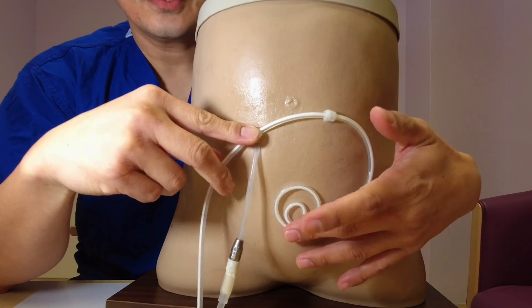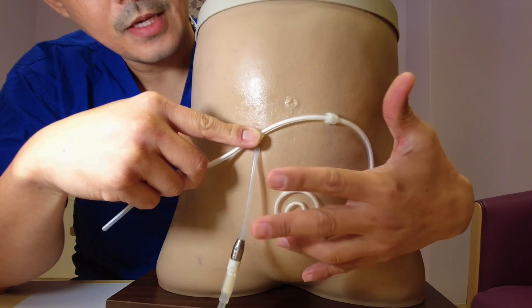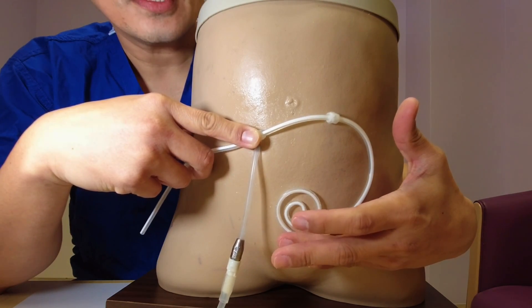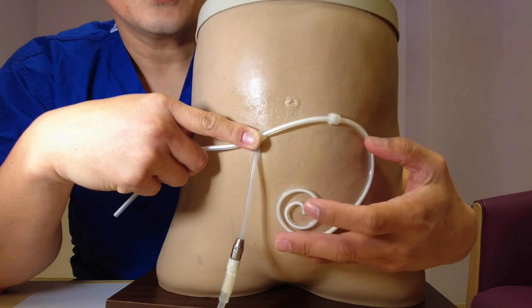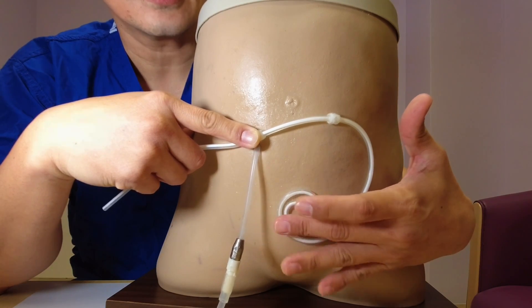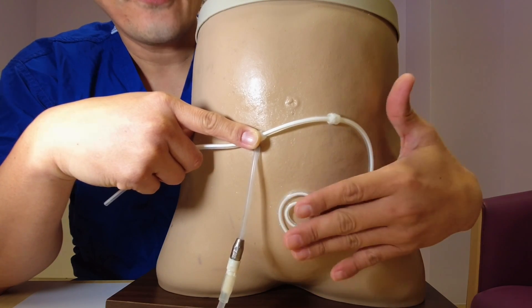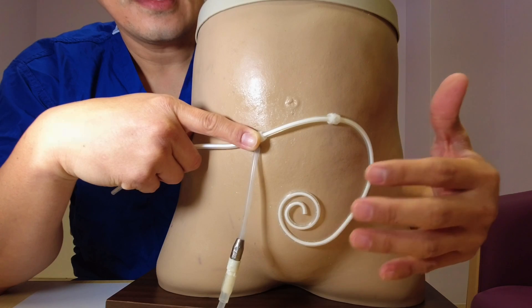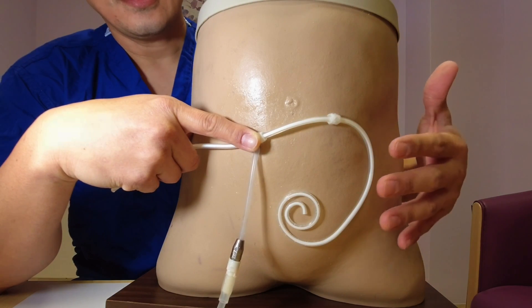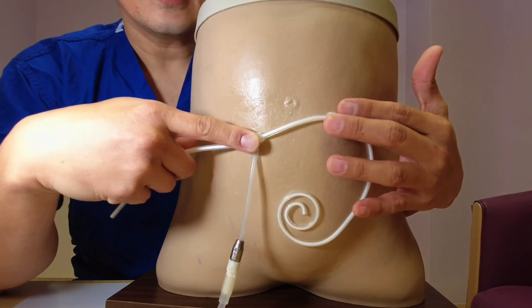We put the solution inside and it drains through this catheter. Normally, depending on the size of the patient, we'll put between 1200 to 2000 or 2500 mils of solution inside the peritoneum — that is your fill volume. Normally, it sits in there for four to six hours, and after that we drain it out again.